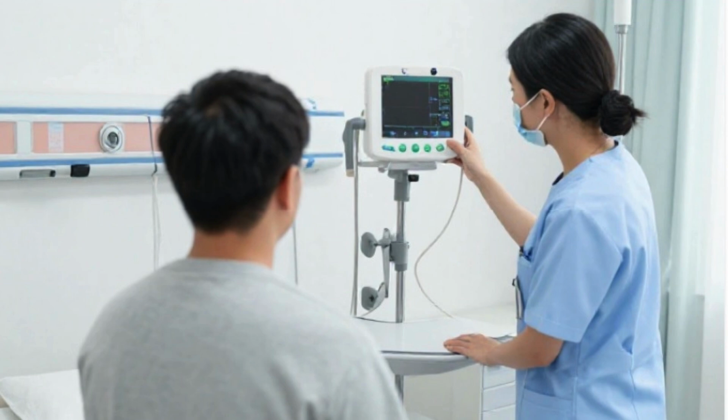13. Why is network connectivity important in modern patient monitors? A. To reduce power consumption. B. To transmit data to central systems or medical records. C. To replace sensor cables. D. To eliminate alarms. 14. Why is electrical isolation essential in patient monitoring systems? A. To improve display quality. B. To prevent electric shock. C. To increase data storage. D. To speed up signal processing.